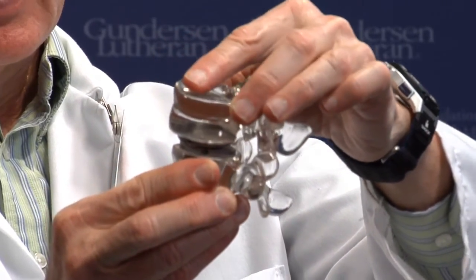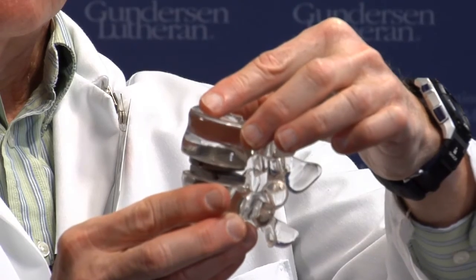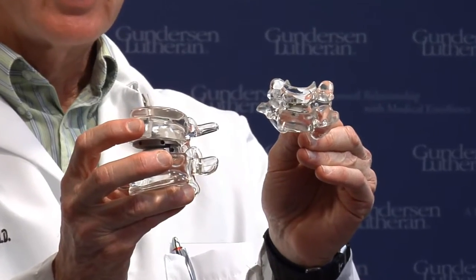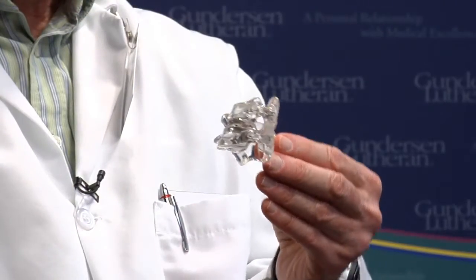It also allows a very limited amount of rotational movement. This is the cervical arthroplasty, or total disc device. As you can see, the bones in the cervical spine are quite a bit smaller than the bones in the lumbar spine, but the device is very similar.